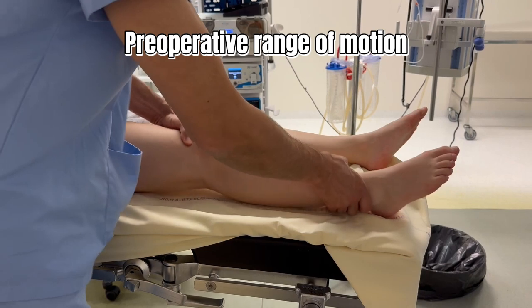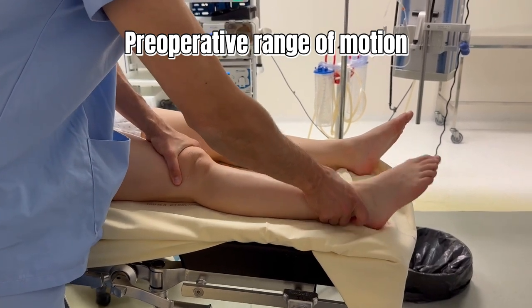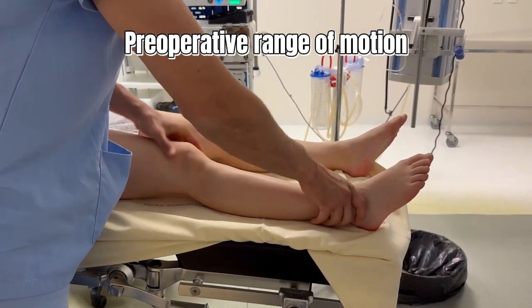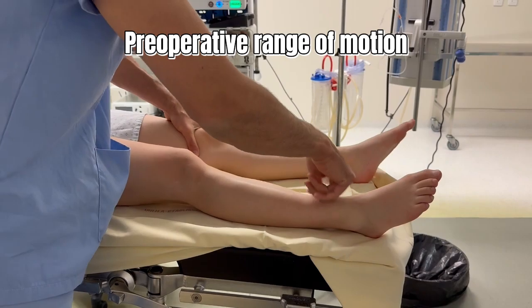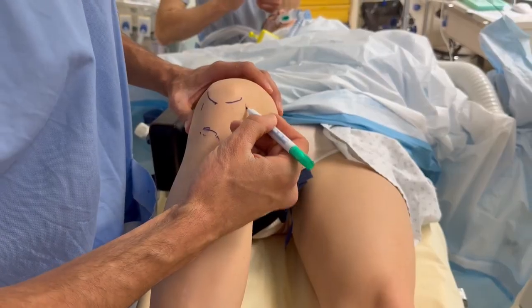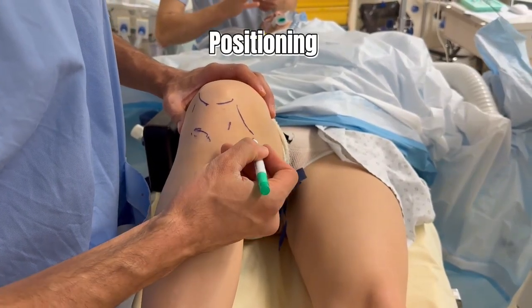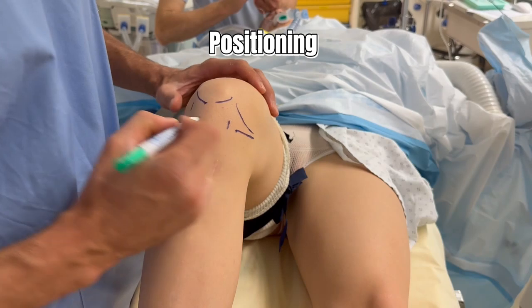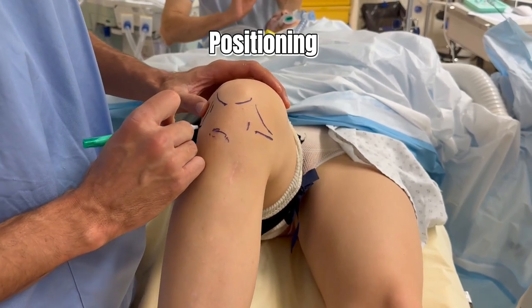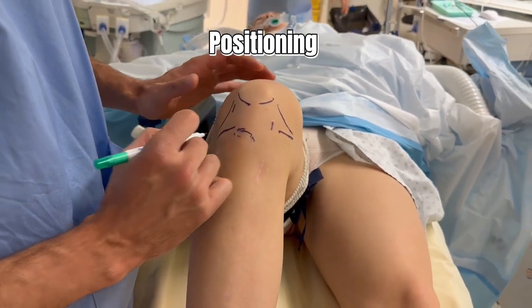Begin the procedure with a bilateral assessment of knee extension to document the preoperative range of motion. The patient is positioned supine with the knee flexed to 90 degrees to maximize the distance from surrounding neurovascular structures.